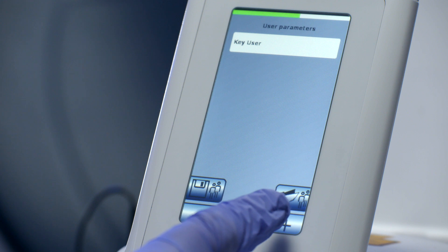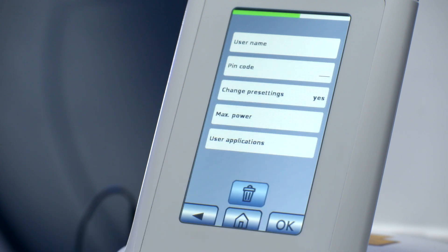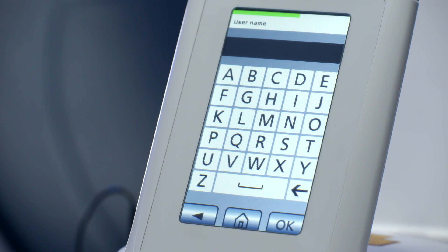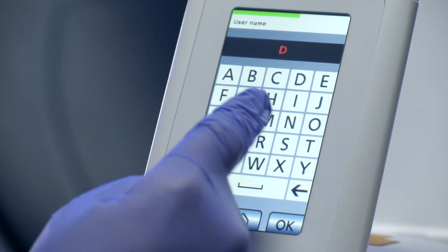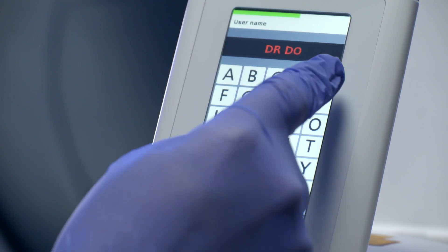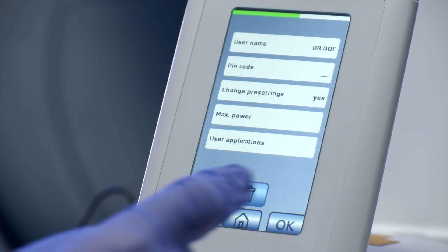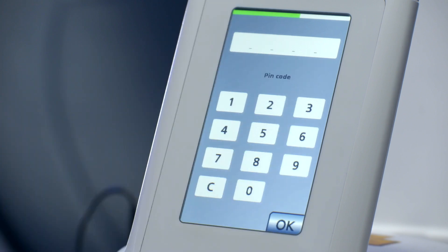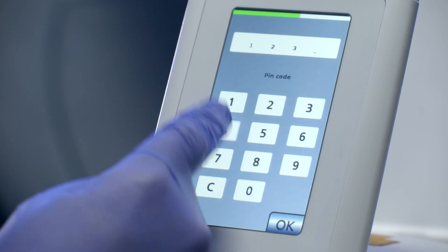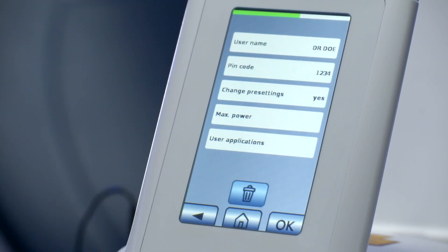Start creating a new user profile by pushing the New button. Enter the name, then enter the personal PIN code.